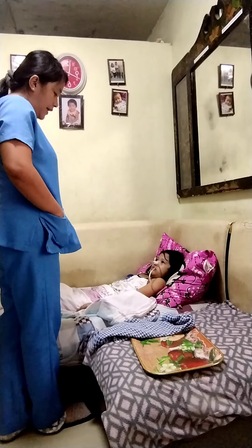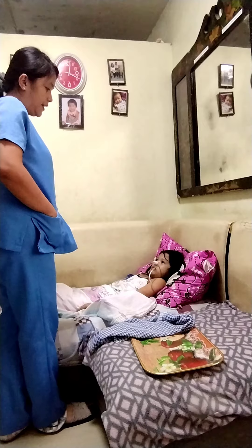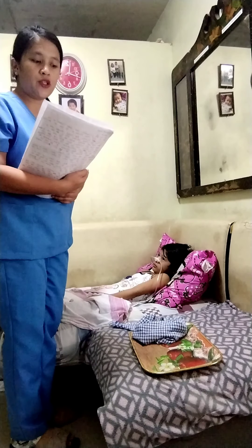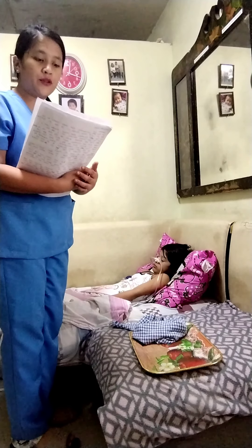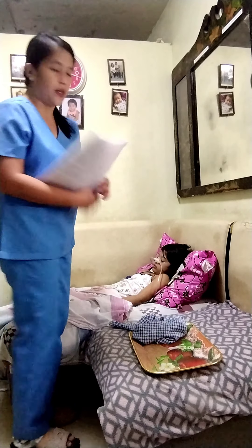Hi mom, I'm Roxanne Makasaet. I'm your caregiver for today. Next, we're going to put the patient in the semi-Fowler's position and then put the towel on the chest of the patient.